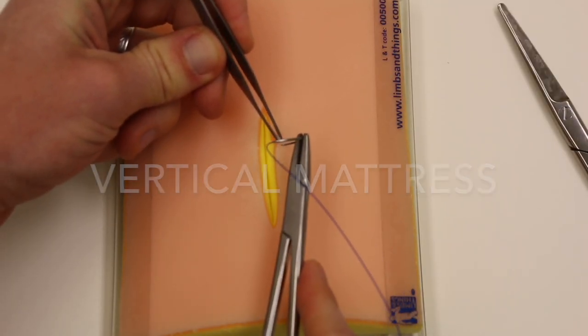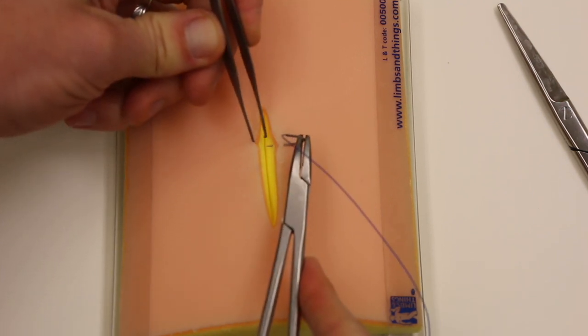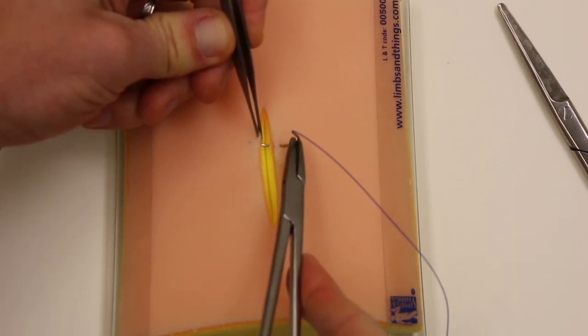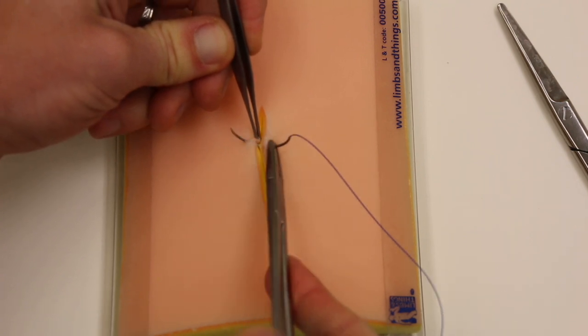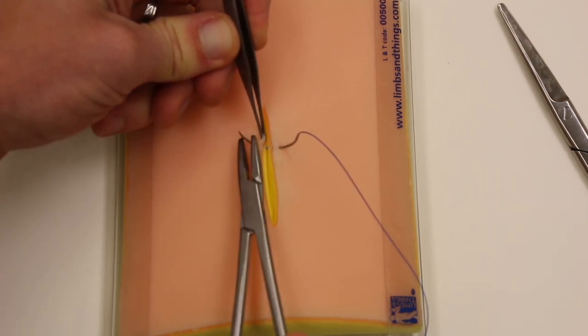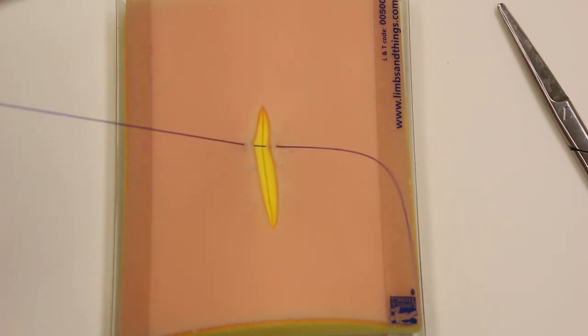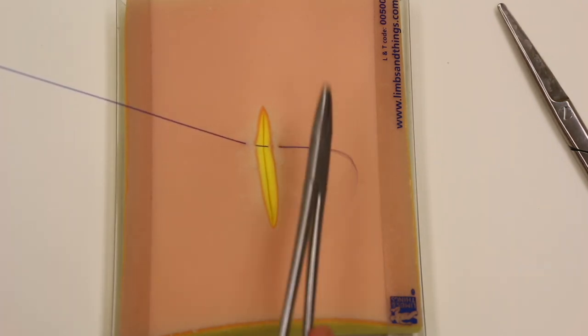Going relatively near the skin edge to relatively near the skin edge. Pulling through, leave a little bit of tail initially. About that much is pretty good.